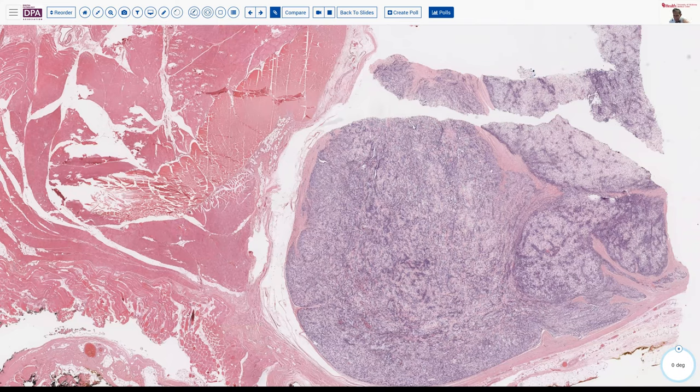So the first question is, would we call this a poorly differentiated spindle cell sarcoma with osseous and cartilaginous metaplasia instead of extraskeletal osteosarcoma? I'm a bit of a purist in that regard. I think if a tumor is capable of making bone, because osteosarcoma is so significant a diagnosis, you wouldn't want them to forego the treatment that might be helpful in that situation. So I would prefer that it be diagnosed as osteosarcoma in that situation.